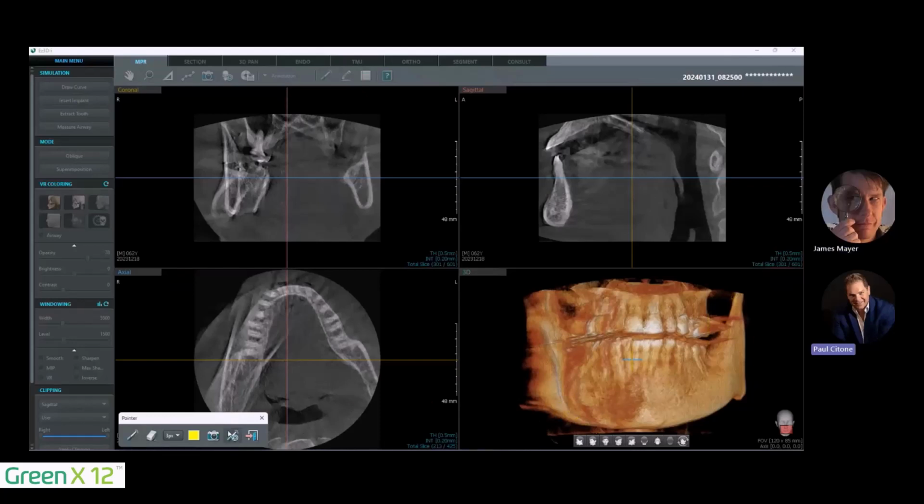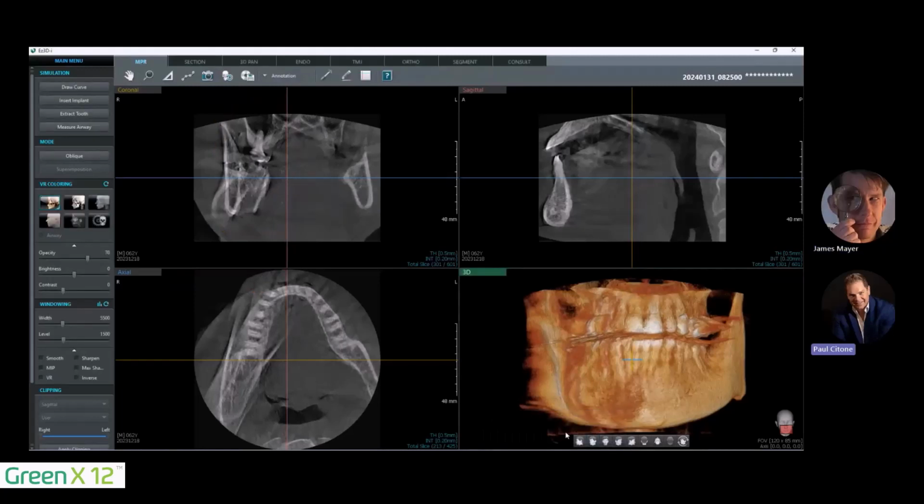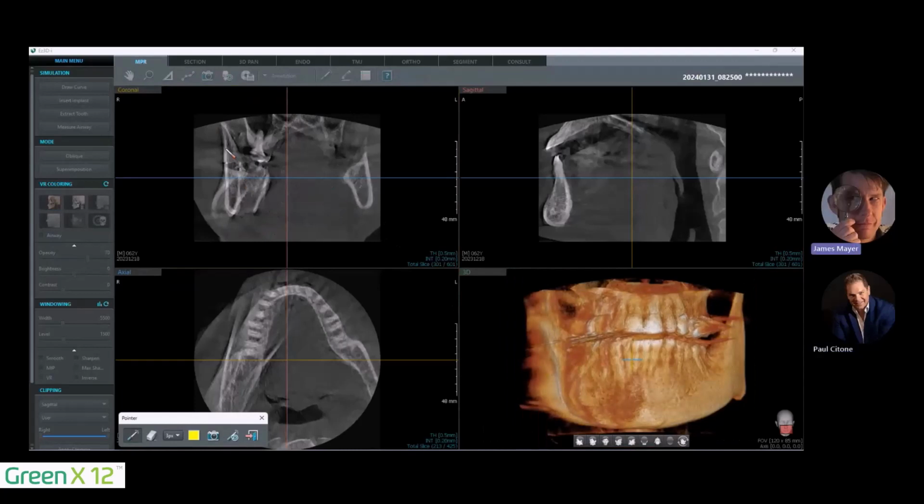And you can see it especially in the coronal view, where they probably moved their whole head, moving that jaw left and right there, creating that kind of ghosted image. You kind of see the jaw there about 3 times, creating that overlapping ghosting image. Yeah, I agree. So I'm following the ramus down here, and then as you described, here's another ghosting. You can see a lot of ghosting through here.